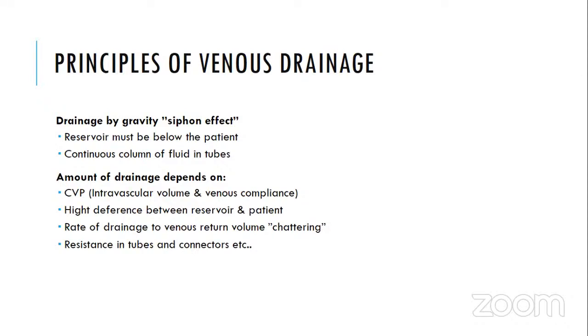The amount of drainage depends on the CVP or intravascular volume and venous compliance, the height difference between the reservoir and the patient, the rate of drainage relative to venous return volume, like chattering, and resistance in tubes and connectors.